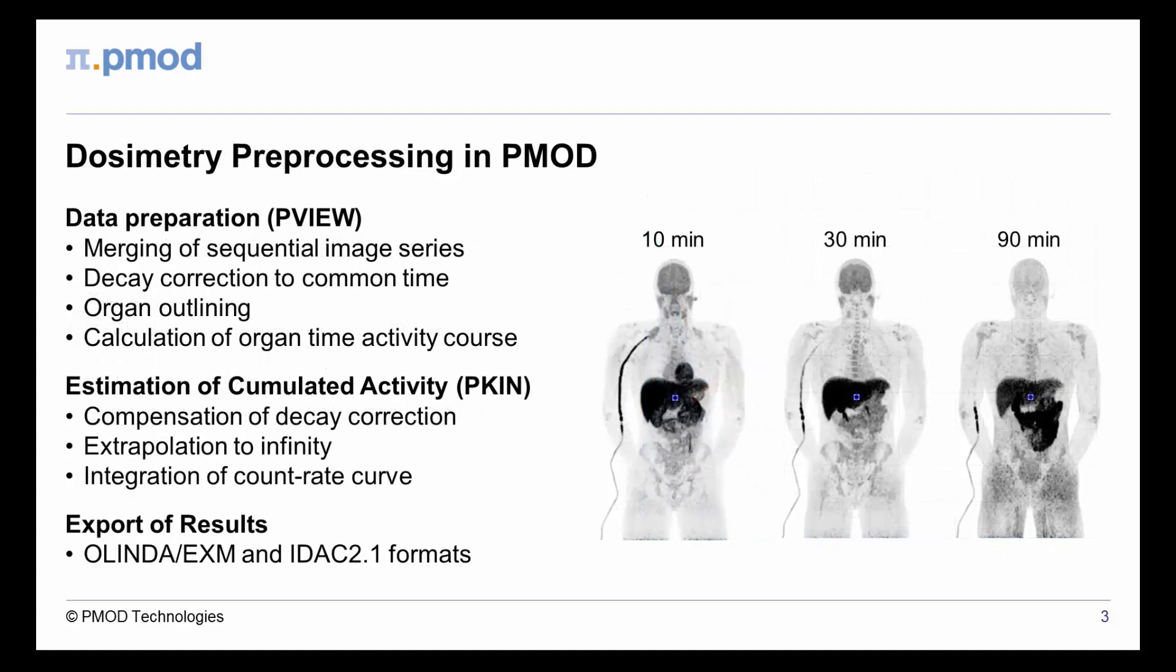PMOD supports all relevant preprocessing steps. A sequence of static images can be combined into a dynamic series with common decay correction. After organ outlining, the activity time course is calculated and transferred to the modeling tool. There, decay correction is undone and the curve integral calculated.